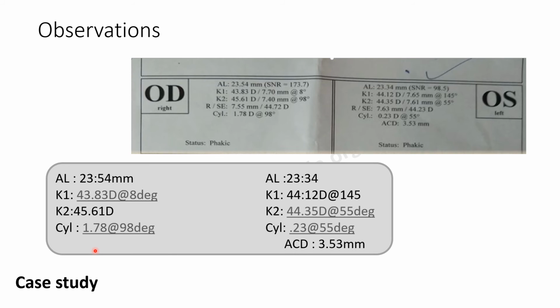So the fundamental aspect of keratometry is that you should always see whether there is a cylindrical difference of more than one diopter in two eyes. If so, a topography may need to be done, or dry eyes need to be ruled out.